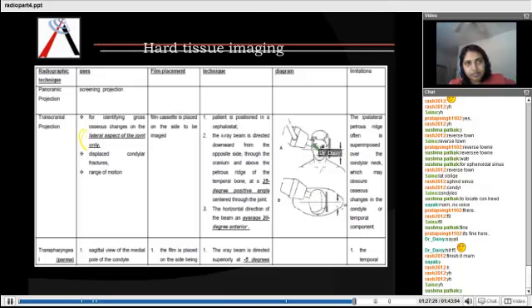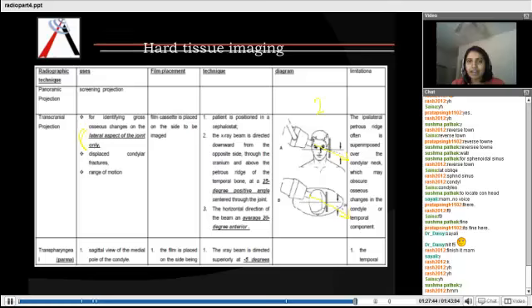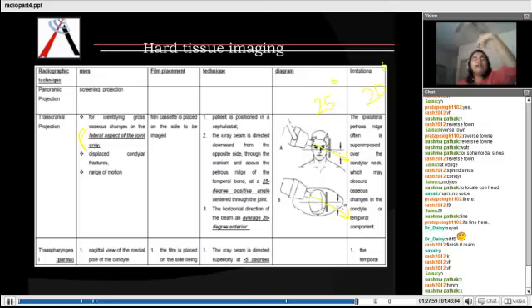See it here? It's forwards and downwards. Okay, so when we talk about the downward angle, it is always called the positive angle. It's 25 degrees downwards and it's 20 degrees forwards. Now when we talk about 25 degrees downwards and forwards, we could put it anywhere, right? But where exactly are we putting it?